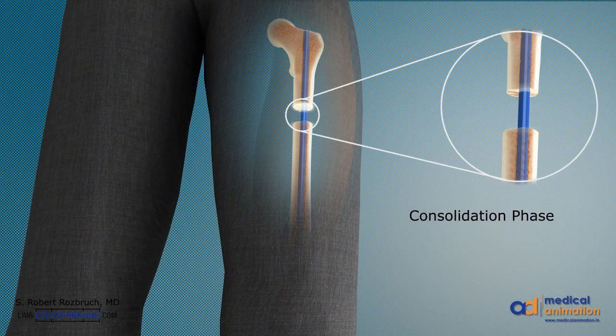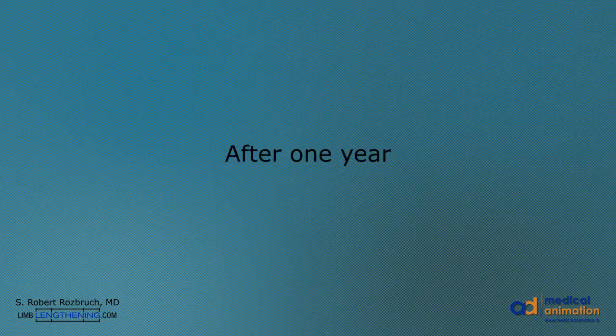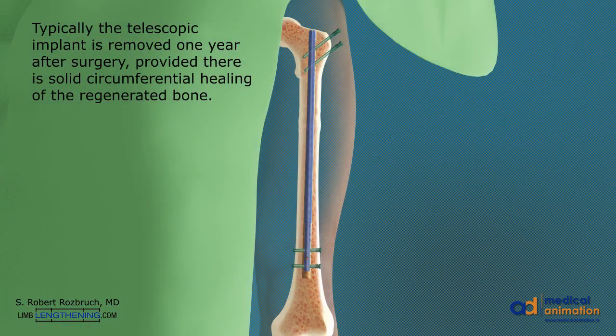During the consolidation phase, the new bone hardens and heals. After one year, the implant is typically removed through the same small incisions.